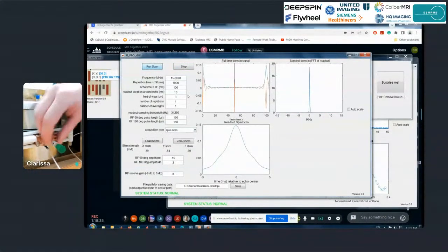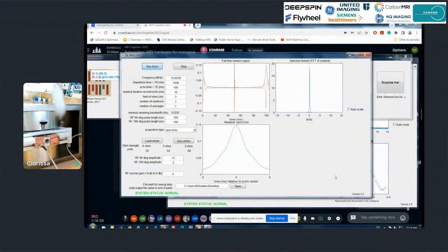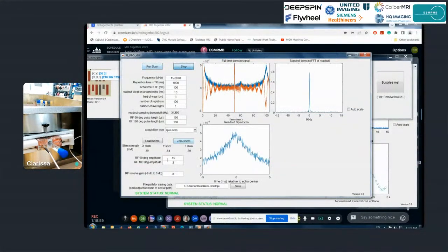Okay, but we can go back. We're going to put in another phantom now. We do a lab in the class with a mystery phantom, and we cover it so they don't know what's in there, and then they can use this GUI to try to guess what's in there without doing a full reconstruction. So I'm going to increase the repetitions here. We need to do a 1D projection along X. You can reduce TE a little. 50.